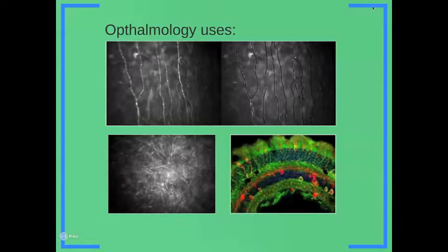researchers used confocal microscopy to visualize keratitis, or the inflammation of the cornea. The fungal filaments present in the eye in a person with keratitis show up as more reflective in the microscope. Thus, confocal microscopy can be used as a non-invasive way for diagnosis of diseases.